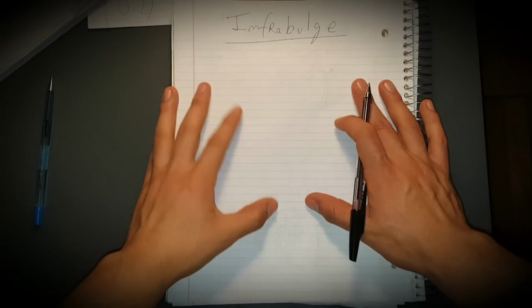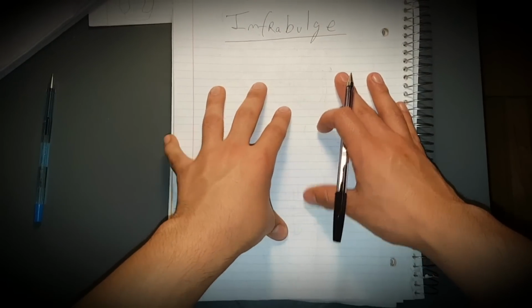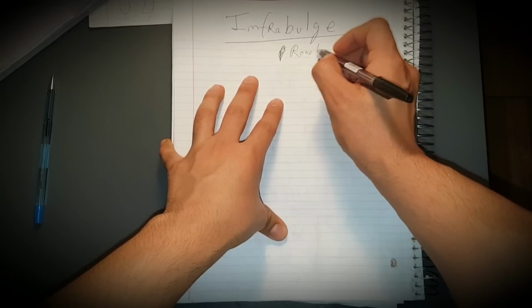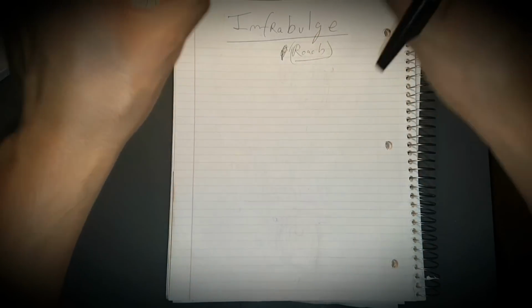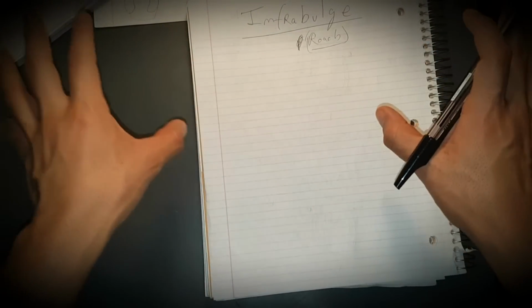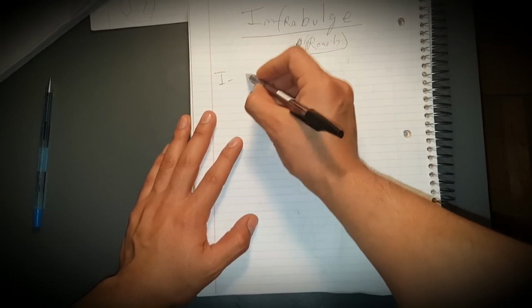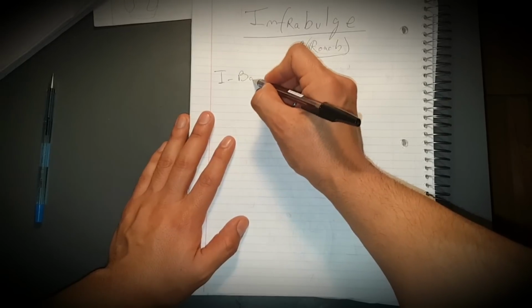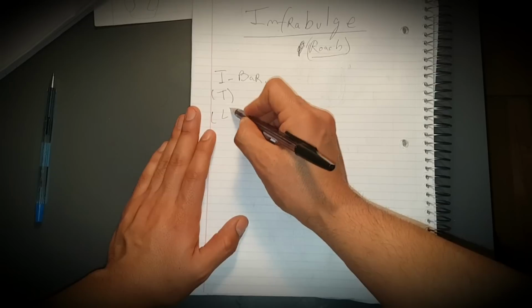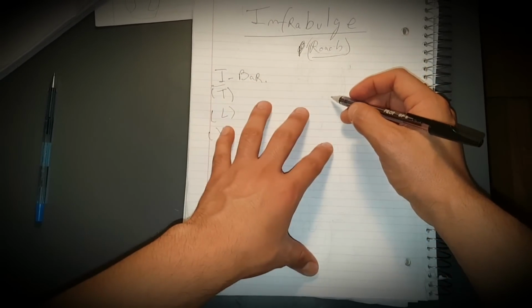So now I'm going to talk about the infrabulge retainers, or infrabulge clasps, also called roach clasps, as we know them in Europe. I'm just going to talk about the ones that we usually use, which are the I bar, or it can be a T bar, an L bar, and a Y bar. It just depends on the design. I'm going to draw it here.